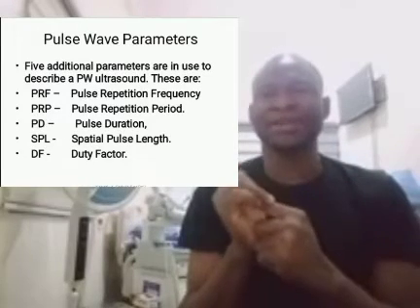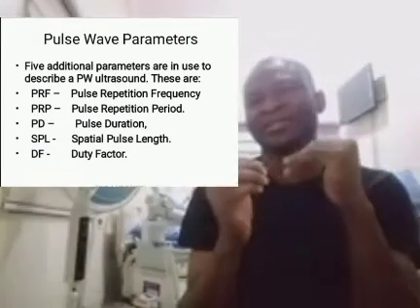DF is duty factor. So we're going to look at each and every one of them and see how these parameters interplay to produce for us the pulse that we'll be listening for echoes to produce an image. So we'll start with the first one, which is pulse repetition frequency. Now this is the number of ultrasound pulses that is transmitted in a second.